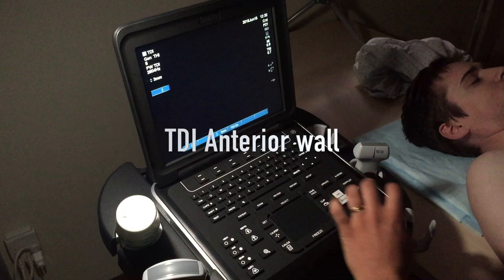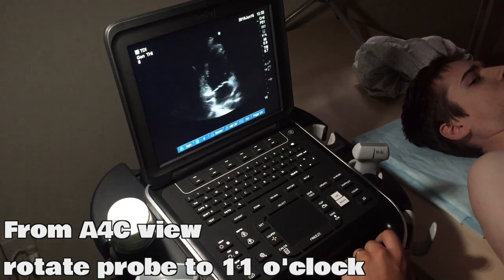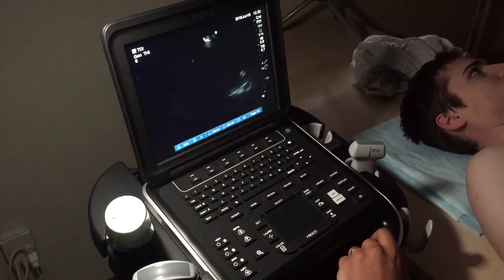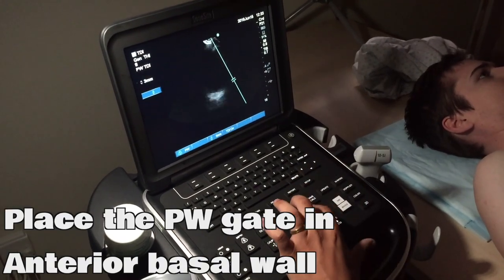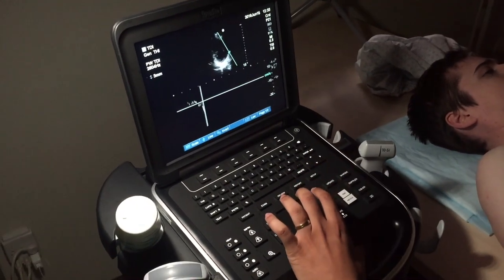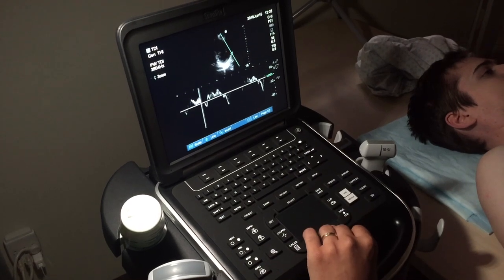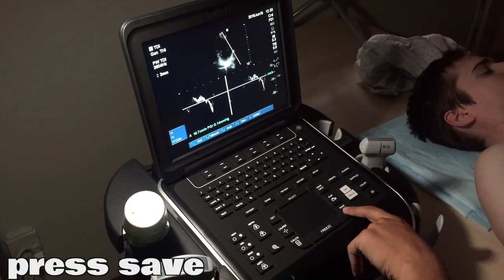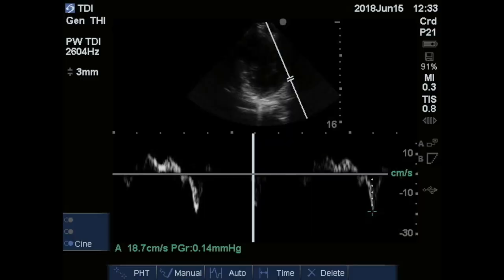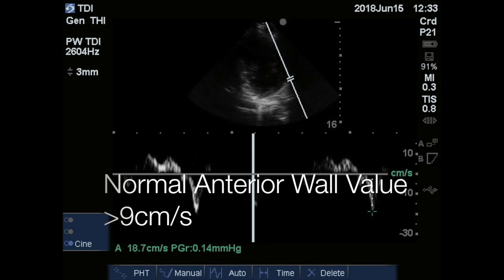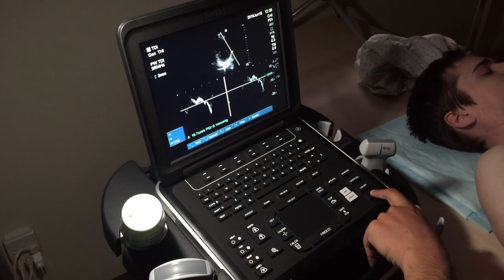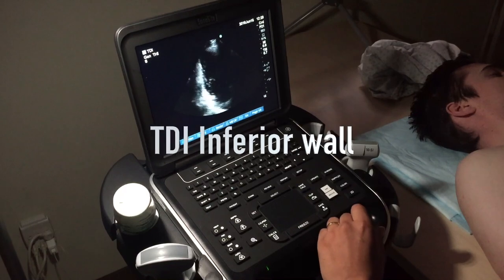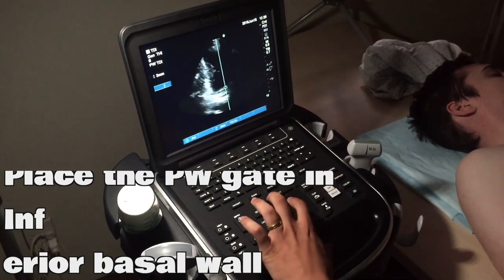Measuring the anterior wall of the left ventricle requires you to be in the apical two-chamber view. Otherwise, the steps to recording tissue wall velocity are still the same. Be sure to be aware of the marker on your probe and its placement so that you are aware which wall is anterior and which is inferior. If the marker is facing the 11 o'clock position, then the wall on the indicator side of the screen is the anterior wall. A normal tissue wall velocity for the anterior wall is at least 9 centimeters per second. Follow the same steps to measure the fourth and final wall, the inferior wall, which also has a normal tissue velocity of at least 9 centimeters per second.